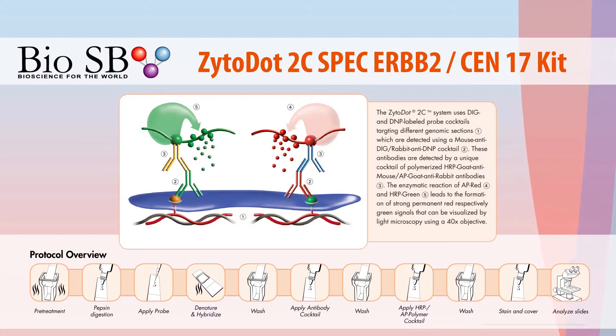Today we will be following the standard ZytoDot 2C Spec ERBB2 or HER2 CEN 17 protocol, which you can find on our website.